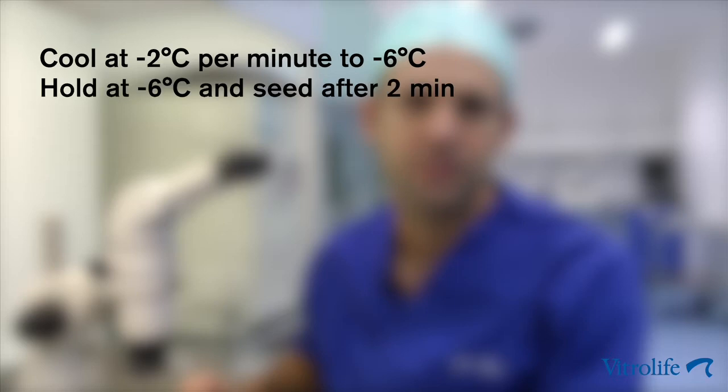Hold at minus 6 degrees Celsius and manually seed after 2 minutes. Keep the straw at minus 6 degrees Celsius for a total time of 10 minutes. Do not seed close to the embryo.